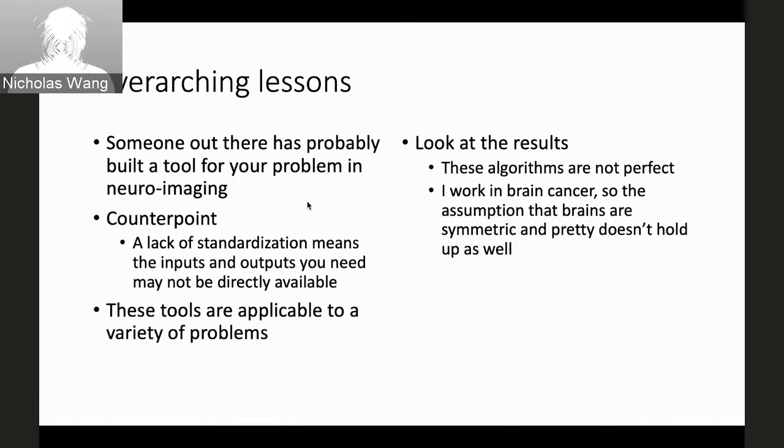If you only need something to strip the skull, or to segment a tumor, or to do image registration, or whatever it may be, there's not a real reason for you to try and roll your own tool for a lot of these problems. It probably takes longer, and it's probably less well supported. So just take a look to see what kind of packages exist for image handling, pre-processing and visualization. There are some nicely documented packages out there as well.